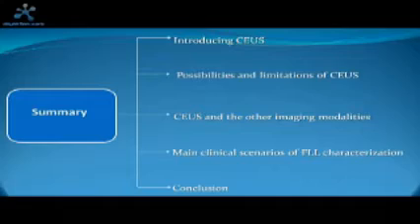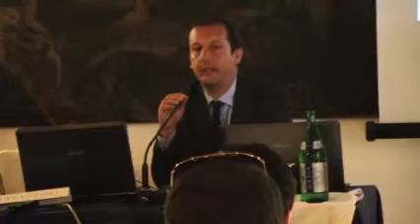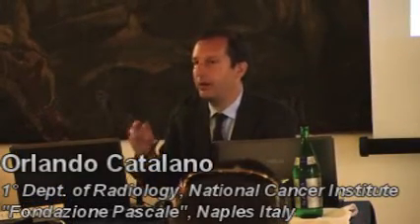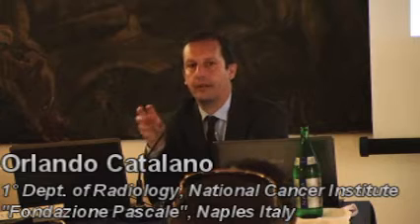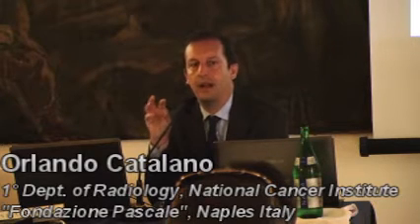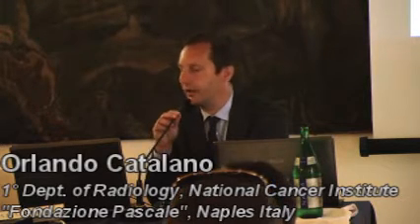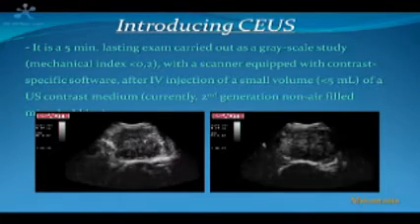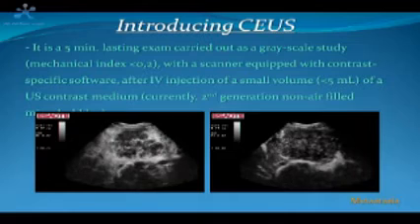And we will try to discuss the role of CEUS in comparison with the other imaging modalities for the liver, and then we will go deep into the focus of this discussion, that is characterization of focal liver lesions. And finally we will try to discuss some conclusions.